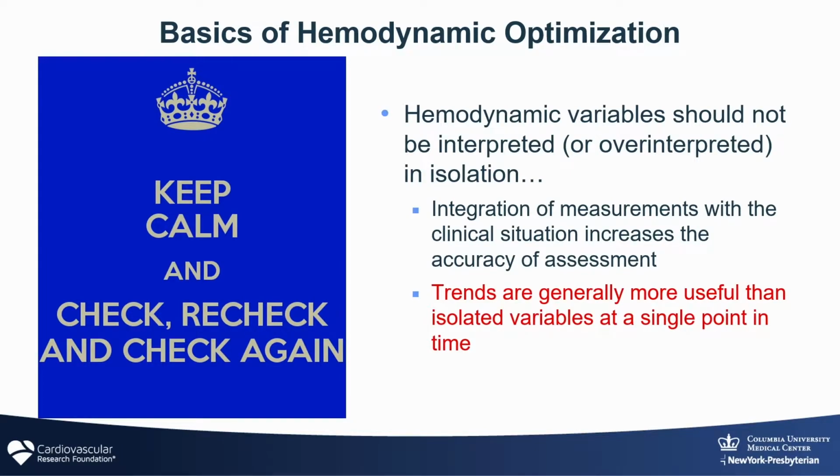That case we heard presented earlier by Dr. Owen, as I said, what we would typically do in that case is we would make an adjustment, keep the patient in the lab, see if what we did made a difference, and then maybe obviate the need for a device and then determine if things were going well.